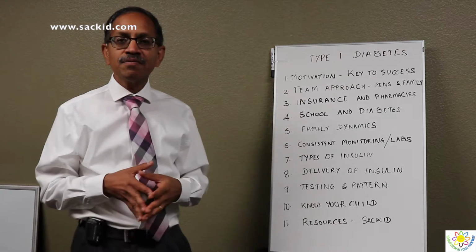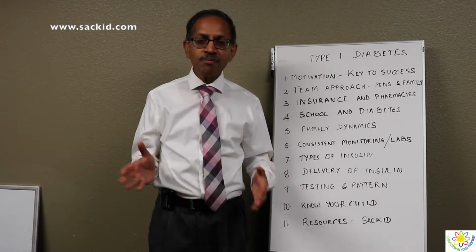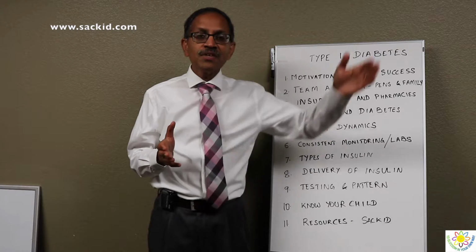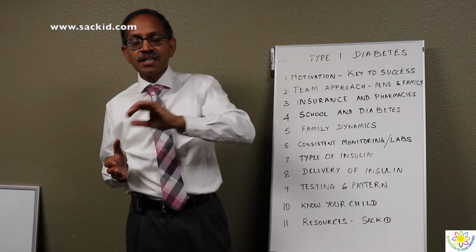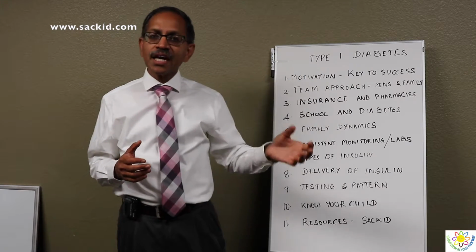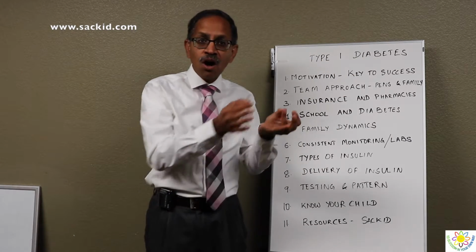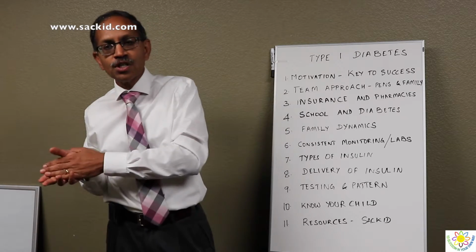The third part of insulin delivery is using an insulin pump. Insulin pumps come in two different formats. An insulin pump which has an integrated glucose sensor, which will enable it to adjust the insulin dose as it is delivered, is called a sensor augmented pump. And then the second kind of pump gives insulin and you use the data from the glucose sensor or blood sugar monitoring to decide on what dose of insulin to be given.